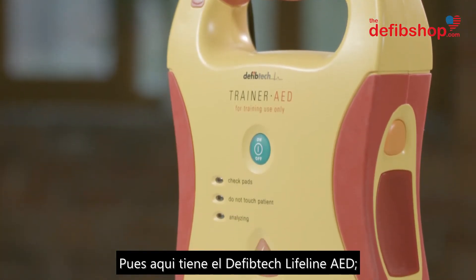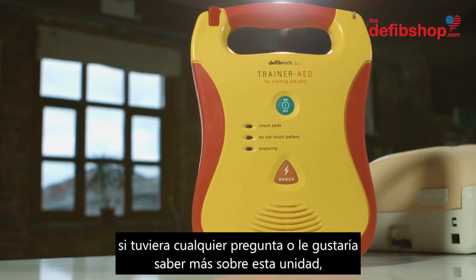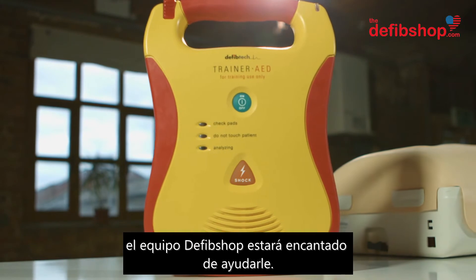So there you have the DefibTech Lifeline AED. If you have any questions or would like to learn more about this unit, the DefibShop team will be happy to help.